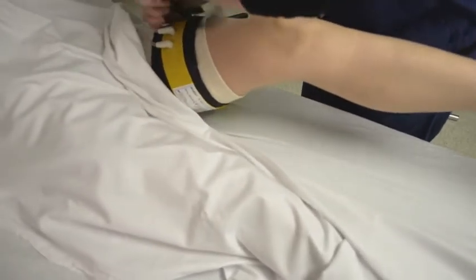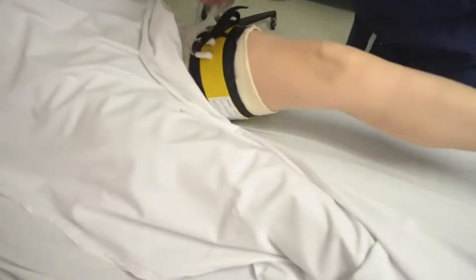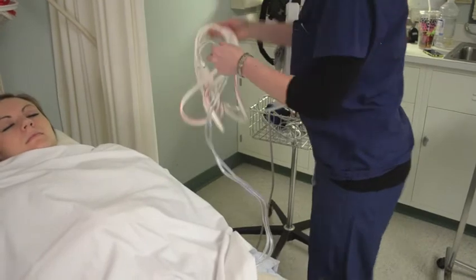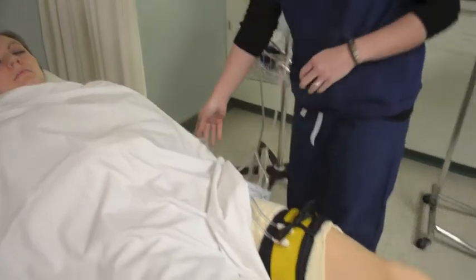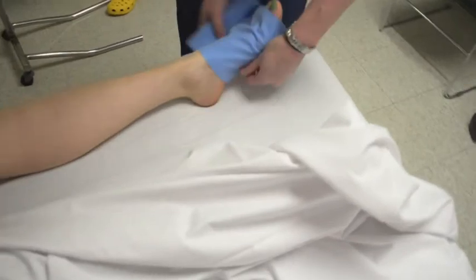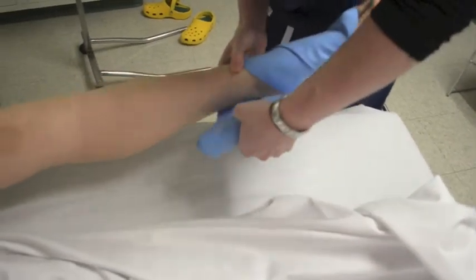After it is secured, the connective tubing is connected to the pressure device. This pressure device delivers and calibrates air at the selected pressure from the surgeon. After this patient is prepped and draped in sterile fashion, the extremity is then exsanguinated with an Esmarch bandage.